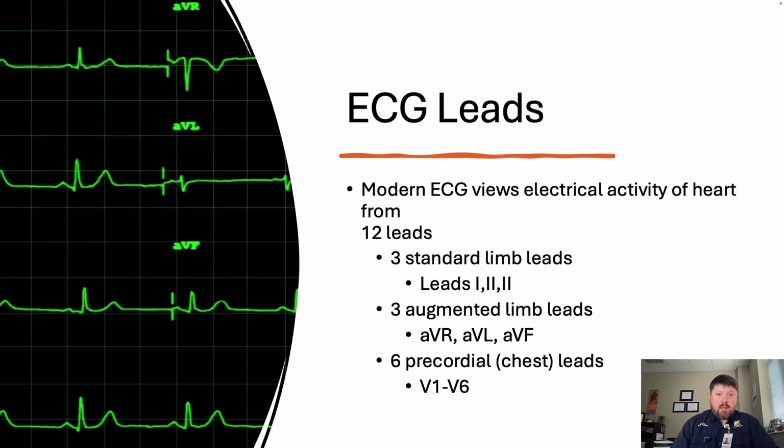All right, so your white lead, your black lead, so your right arm, your left arm, and then your red lead, your left leg. Those are your 3 basic leads there. Now, most machines have that green, which is a 4th, and it takes into account for that as well. But for basic monitoring function, you need to know your white, your black, and your red.